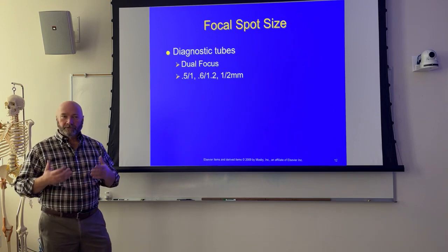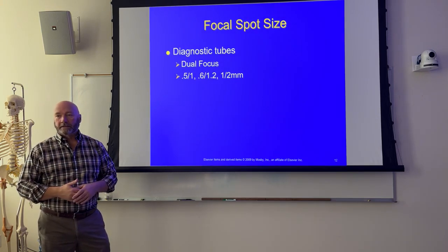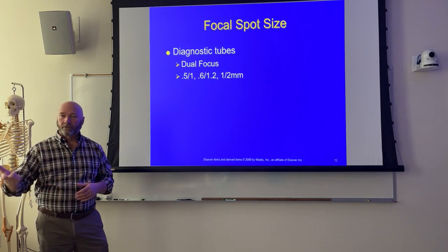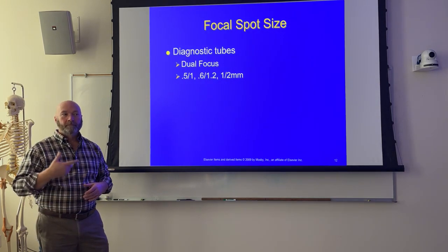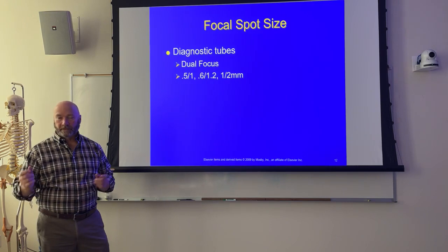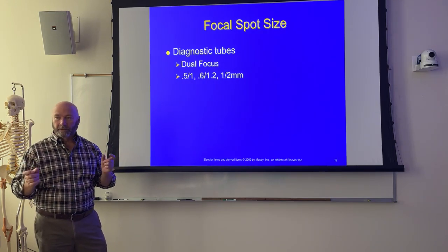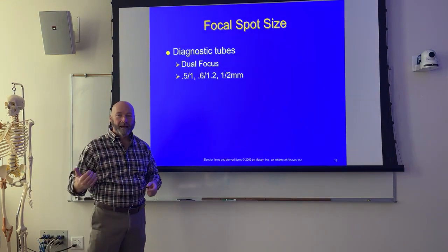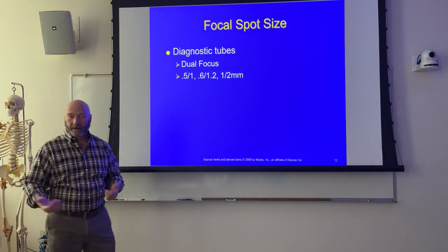Umbra means that you've got very good fine lines. Right? And it's a word that we don't use quite as much, but the other word means loss of sharpness for recorded detail and fuzziness on the sides. You remember what that word was? Penumbra, exactly. So penumbra, bad, umbra, good, right?